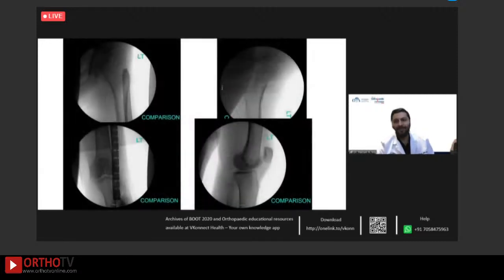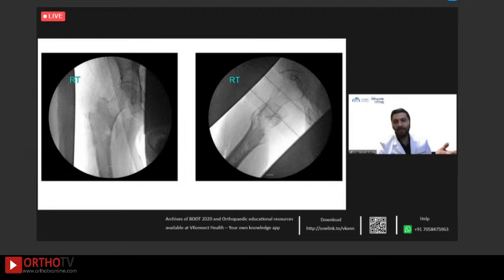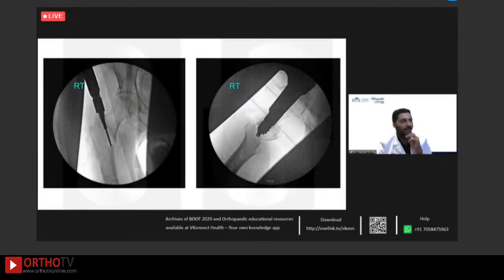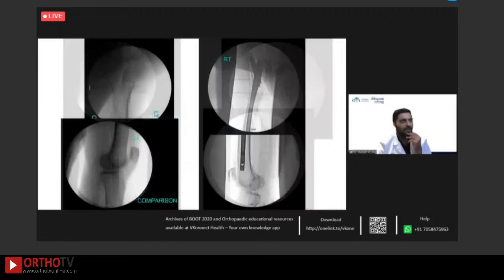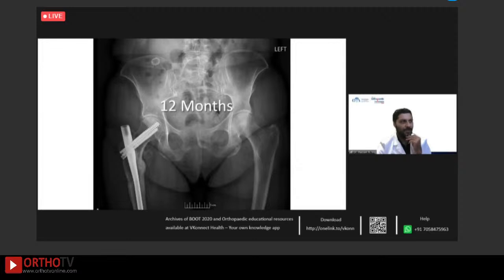Again, just similar to the last case, planning with length, alignment and rotation of the uninjured limb. And then here this was after simply taking off the prior implant and having her on a traction table, now it aligned well. And then just proceeded with nailing and got her length, alignment, and rotation equal to the other side. And here she was at 1 year, healed.